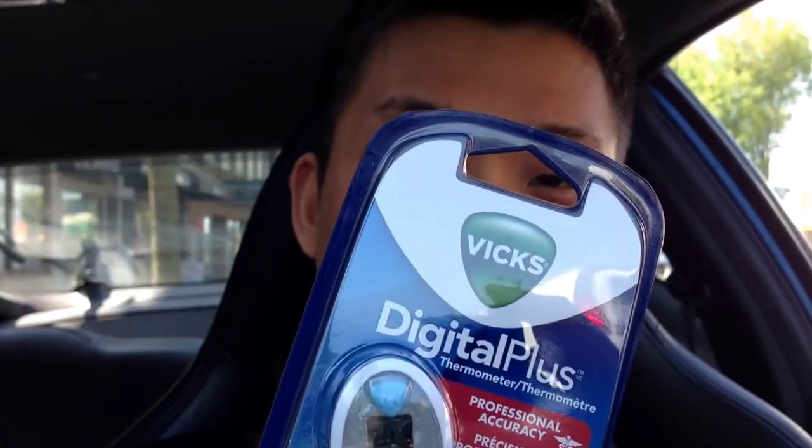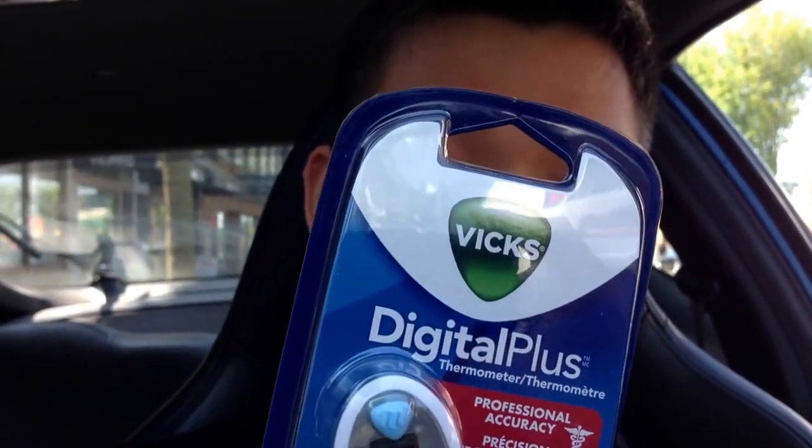Just left London Drugs where we picked up this — it's the VIX Digital Plus Thermometer, equipped with fever signal. I'm sweating like crazy, and the doctor told me to monitor this.